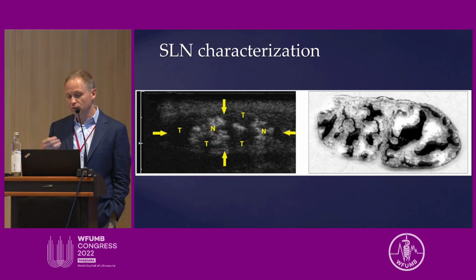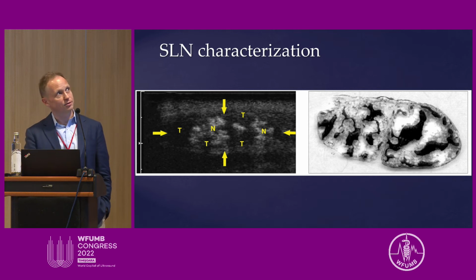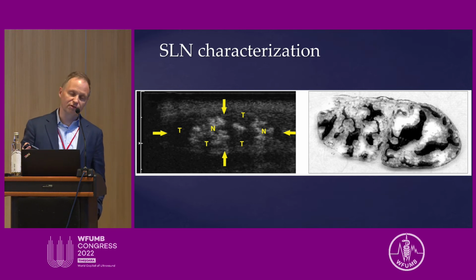But unfortunately, we also saw a lot of lesions like this with patchy enhancement, and we didn't know what to tell about those. And they were split pretty much 50-50.